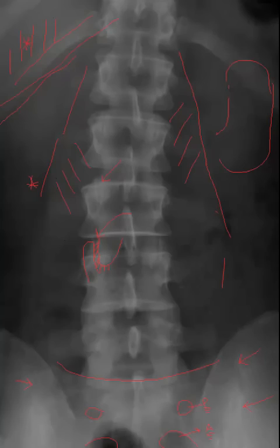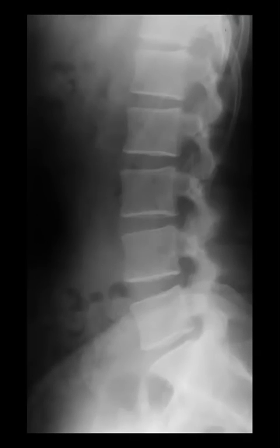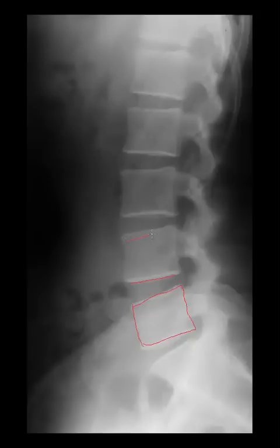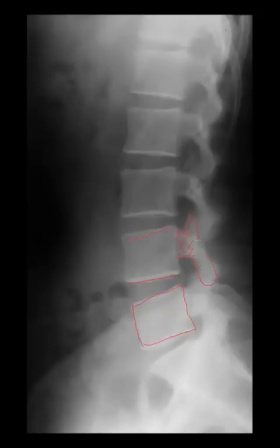Now let's move on to the lateral projection of the lumbar spine. In this projection we can see the lumbar vertebral bodies very nicely, including the vertebral body, inferior end plate, and superior end plate. As we know from previous tutorials, the neck structure posterior to the vertebral body is always the pedicle, seen here very nicely. The next neck structure is the articular pillars — here's the superior articular process, here's the inferior articular process, and here in this area is the pars interarticularis.